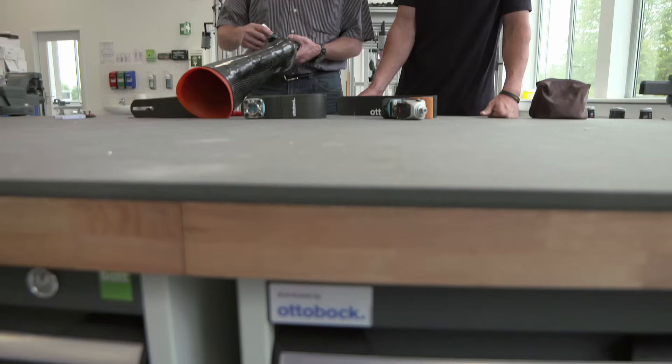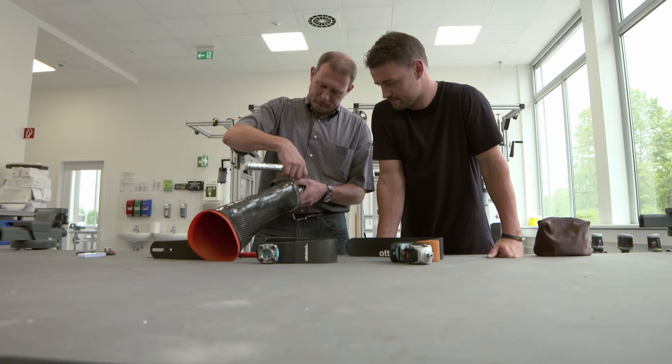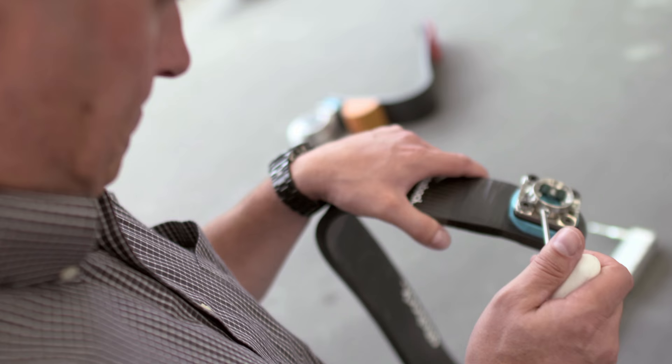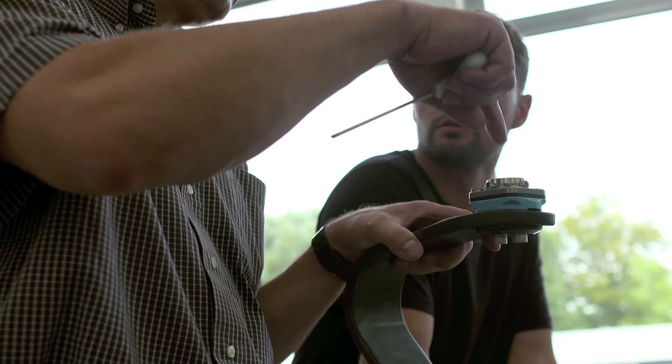Delivery of the blade is only the first step. True precision is obtained when Popov and his team of technicians, led by Jens Nordermann, test the equipment themselves and make the minute changes necessary to aid his comfort and performance.